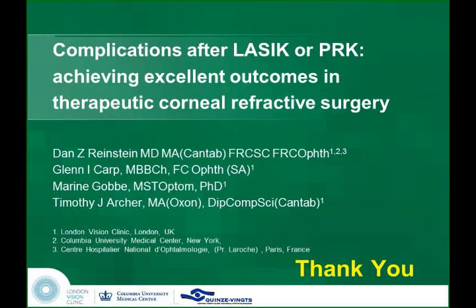So with my laser, it's 6 seconds because that's how long the surface tension of the liquid holds. Yeah, 6 seconds. So for us, it's 20 microns because we're shooting at 250 hertz with a 0.7 millimeter spot. It does 20 microns in an 8 millimeter zone in 6 seconds. So that's why we program 20.